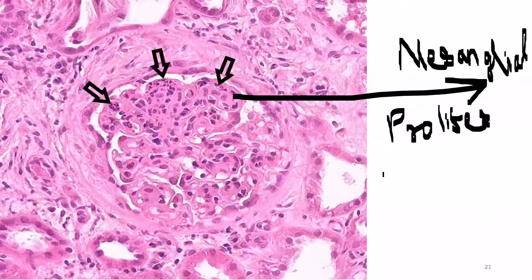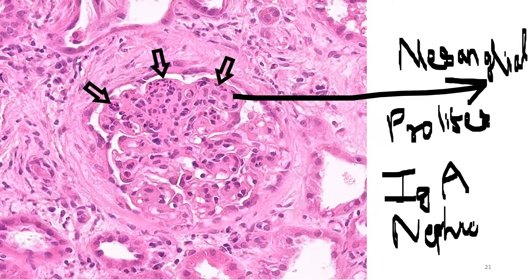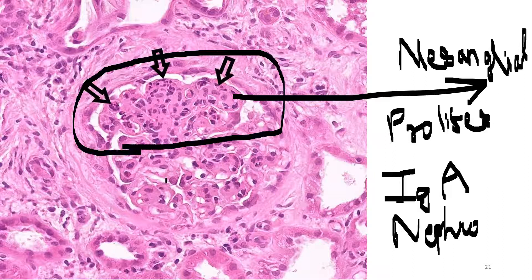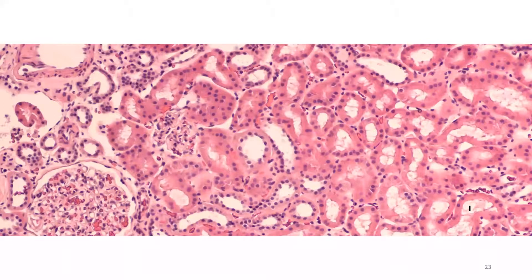This slide shows mesangial proliferation, which is characteristic of IgA nephropathy. When mesangial proliferation is seen on biopsy without a specific clinical case detail, it is mostly associated with IgA nephropathy.